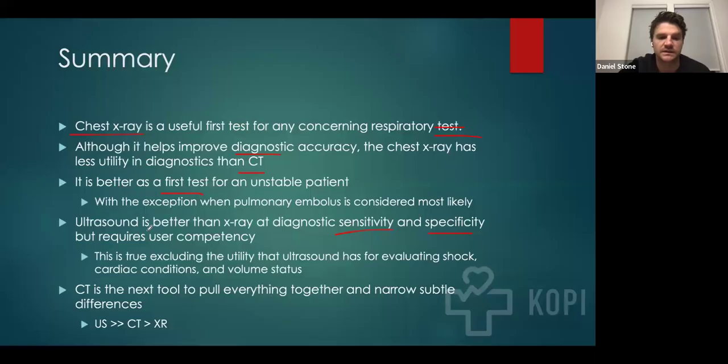It doesn't necessarily require a whole amount of resources like a CT scan or ultrasound. Ultrasound is my personal favorite. I would say that if you could learn any skill to evaluate chest pathology better, it would be ultrasound. In my mind, ultrasound is a little bit better than CT. The reason is that it's a dynamic exam. You can repeat it without cost or radiation. And you can also use it on the heart.